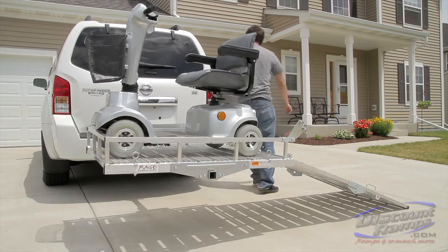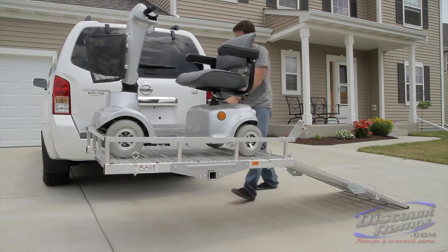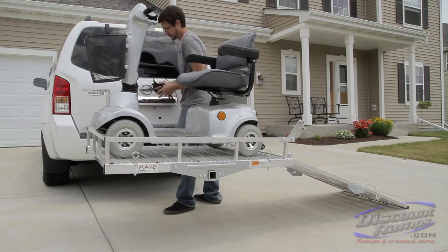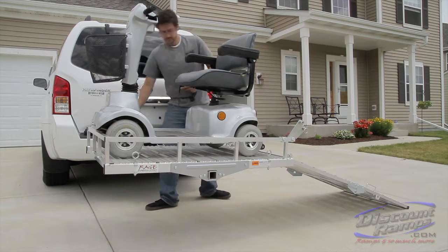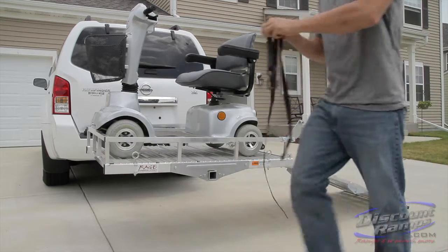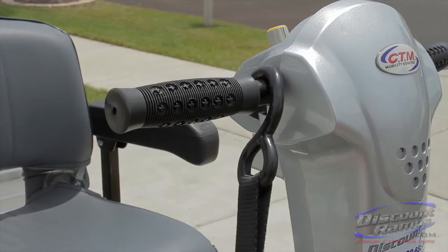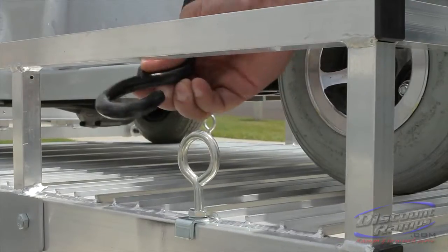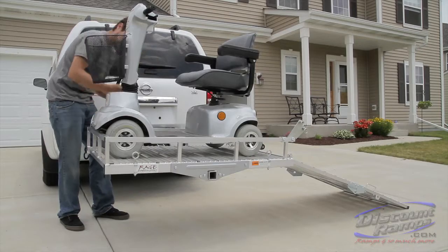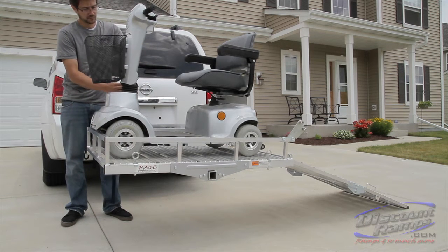Once loaded, secure the scooter to the carrier using tie-down straps. Attach tie-down straps to a secure non-plastic point on the scooter and to the carrier's i-loop bolts. Make sure all straps are tight and secure, and any excess strapping is tied away.